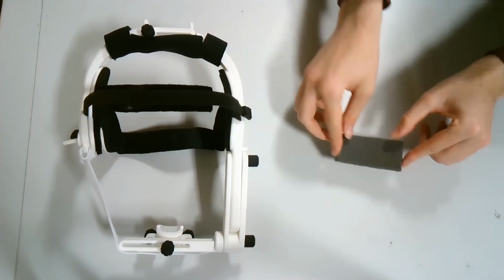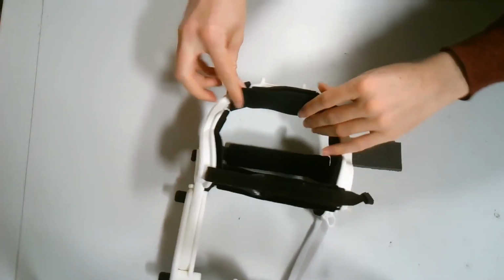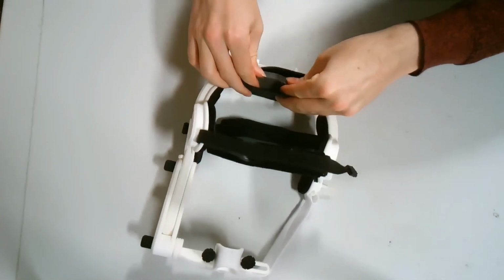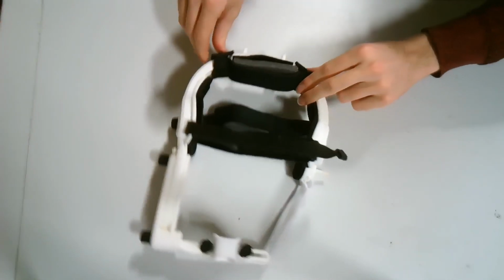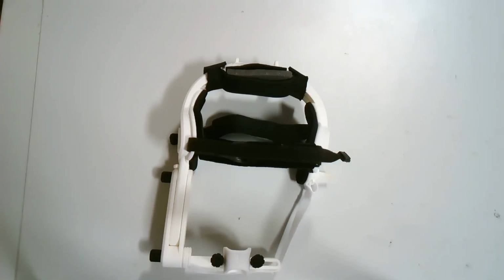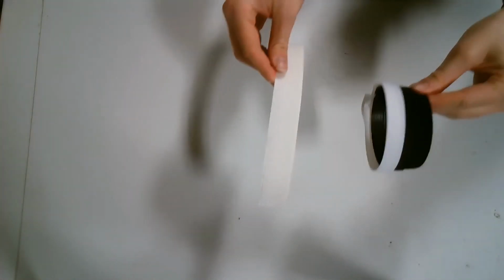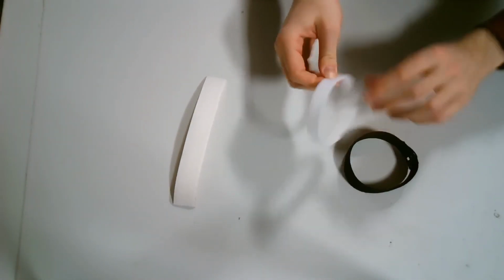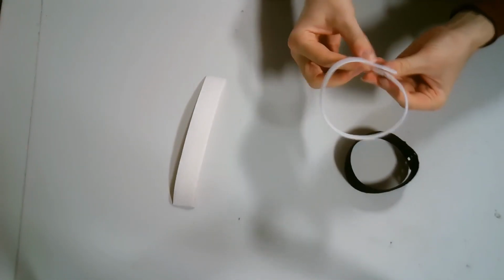If the headset is too large for your participant, you can insert the foam crown pad to make it fit better. Extra Velcro straps and adhesive-backed Velcro are provided in case you need to replace them.